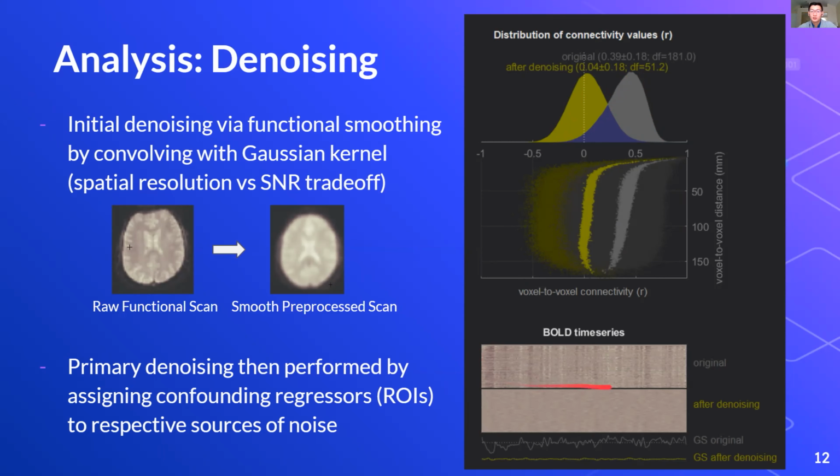On the bottom here, we see it's called a carpet plot. It's basically a 2-dimensional representation of 3-dimensional noise for each subject. As you can see, after denoising, the noise tends to go away. So these are a lot of important steps that need to be taken in order to make sure that fMRI data is accurate and usable.